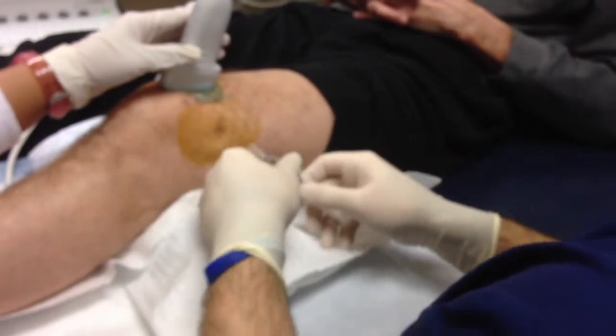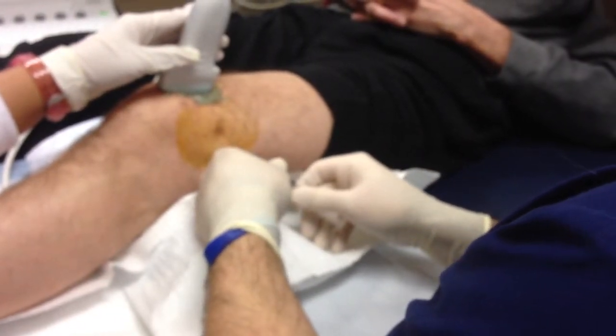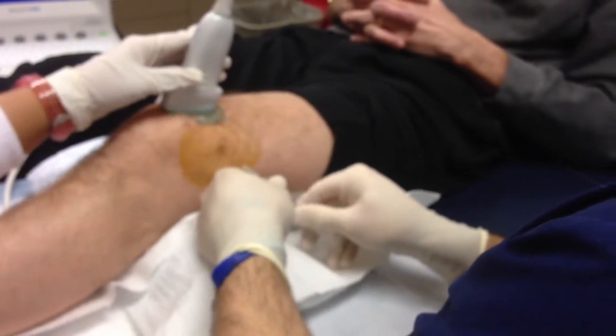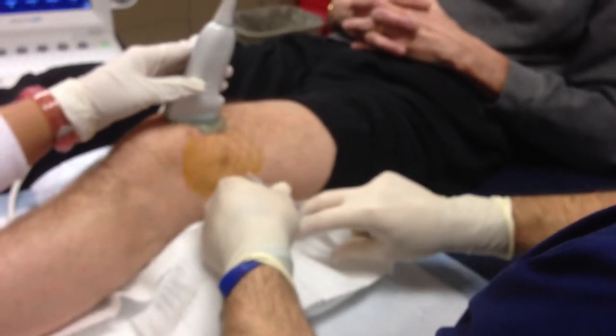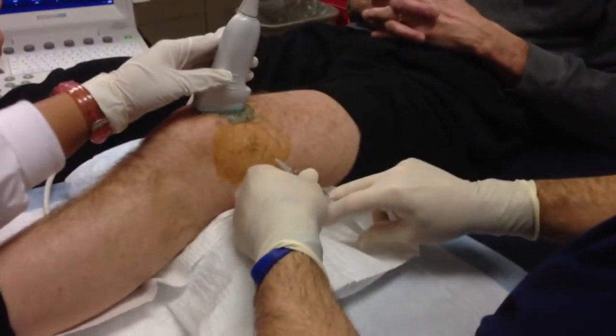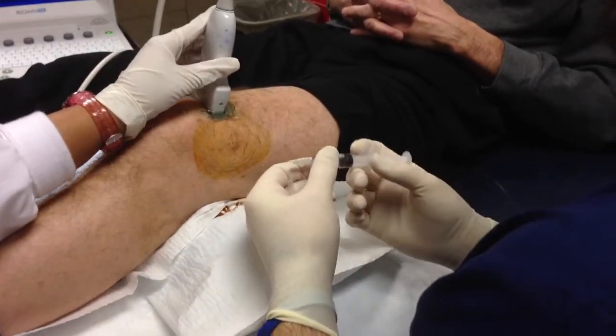What I'm going to do right now is give you a pinch with a little bit of local anesthetic — that always stings. Then I'm going to put local anesthetic in deeper on the track we're going to go. Zyra, you can move to the short axis now.